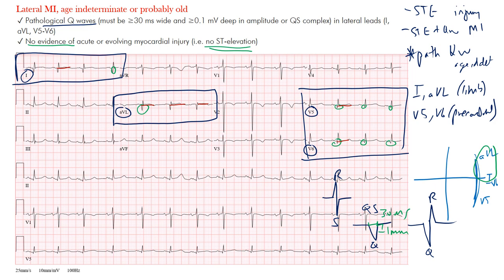In leads I and AVL, clearly you have that lateral MI with those deep Q waves. Notice also that there is no evidence of any ST segment deviation — there's a flat ST segment here, no deviation. This patient had already had an infarct in the past and was just presenting for follow-up. The main findings you're looking for are pathological Q waves and no evidence of acute or evolving myocardial injury — meaning no ST segment deviation — in the lateral leads: I, AVL, V5, and V6. In this case, they were most prominent in I and AVL.